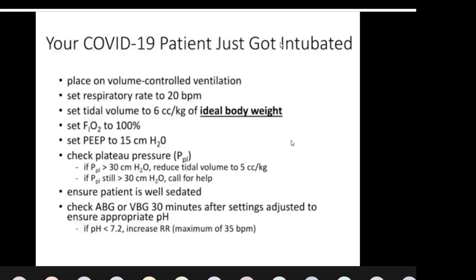That is by looking at the SpO2, and more refinedly by looking at a repeat ABG. So what we would do is look at a repeat ABG for the patient after half an hour to 1 hour, and then we start tuning the ventilator to assess the patient's deficits. As I told earlier, ventilator sedation is the most important thing. Ventilator analgesia is equally important.